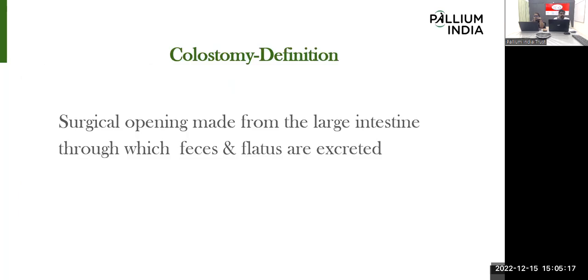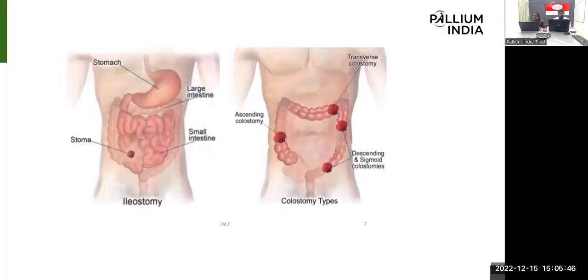Colostomy means what? Like an ostomy, it's a surgical opening and we bring the large intestine part through the opening and place it outside for collecting the fecal matter, mainly for the excretion of the fecal matter and flatus. In colostomy, mainly we do it surgically.